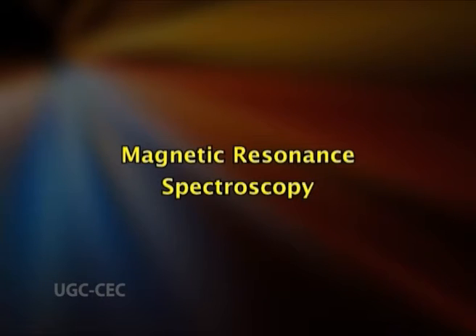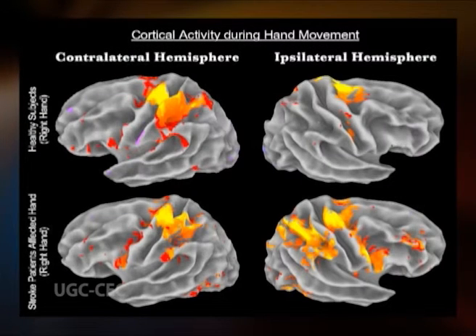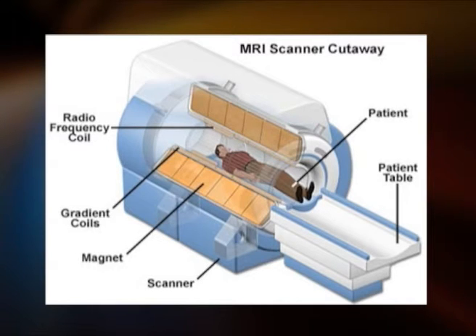At last, now let's talk about magnetic resonance spectroscopy. Magnetic resonance spectroscopy (MRS) is a means of non-invasive physiologic imaging of the brain that measures relative levels of various tissue metabolites. MR spectroscopy is a modality that is available on most state-of-the-art clinical MR scanners.